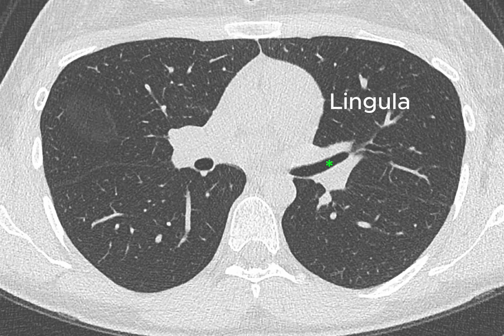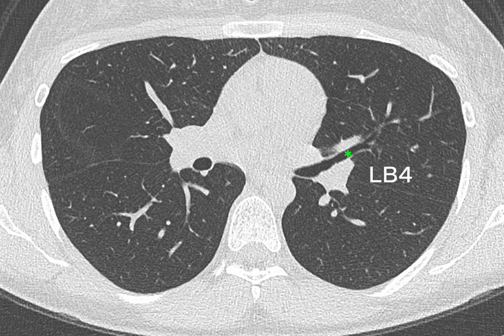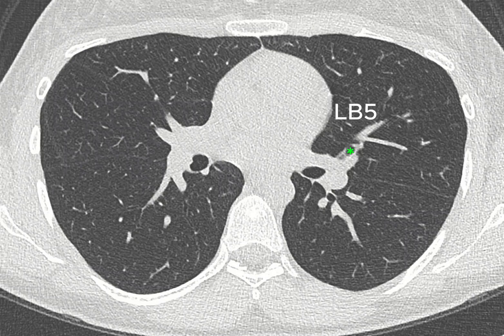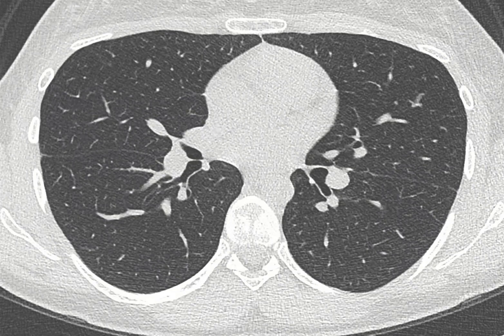As we travel into the lingula, it can get a bit tricky — it's easy to get it wrong because it doesn't have a lateral bifurcation like the medial and lateral branches of the middle lobe. It has a superior branch, the LB4, and an inferior branch, the LB5. The first segment we see entering the left lower lobe bronchus is the LB6, which is very comparable to the number 6 on the right side. Because they have a very dorsal direction, they are great orientation points during bronchoscopy.